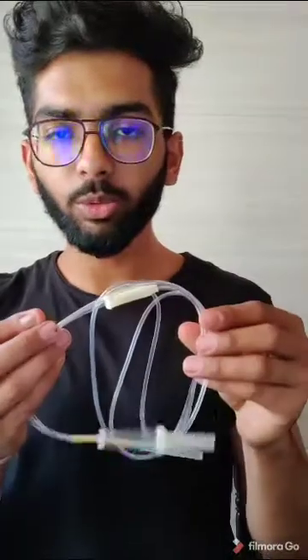Today I'll be showing you the administration of the intravenous infusion of drugs. I have all the things that are needed for the demonstration. I'll be using the NS here. I have an infusion set with me. I have here with me this scalp vein set and the separate needle that I'll be showing the use of later.